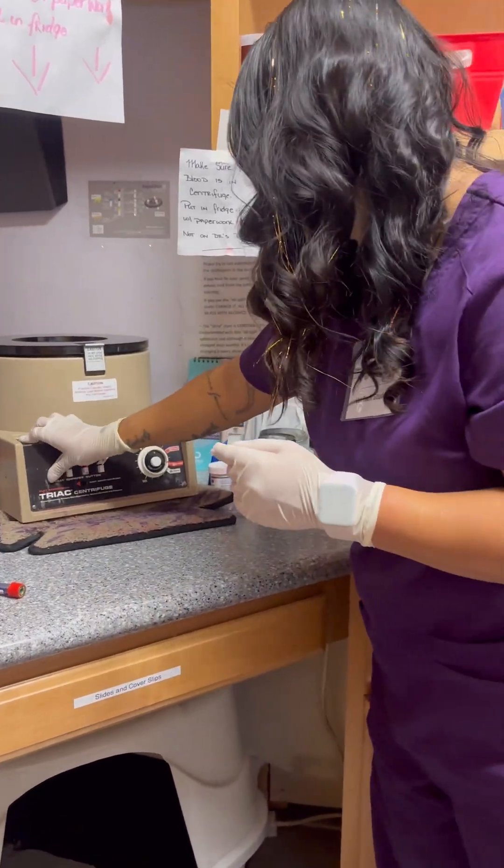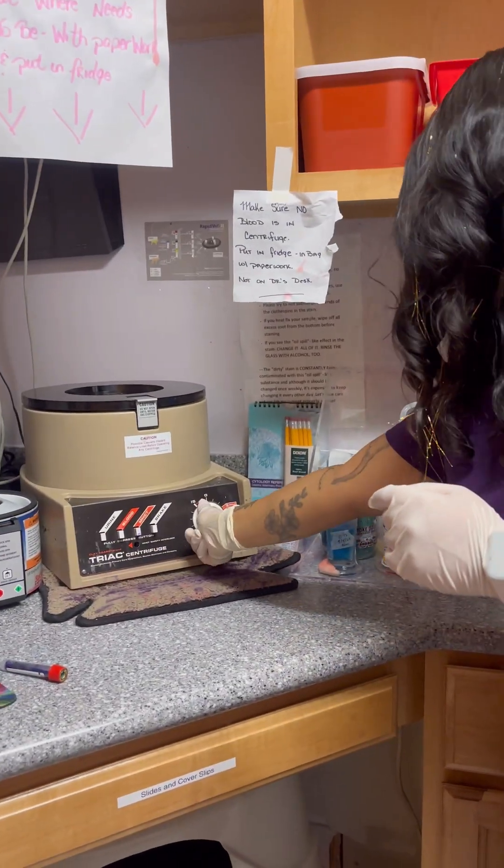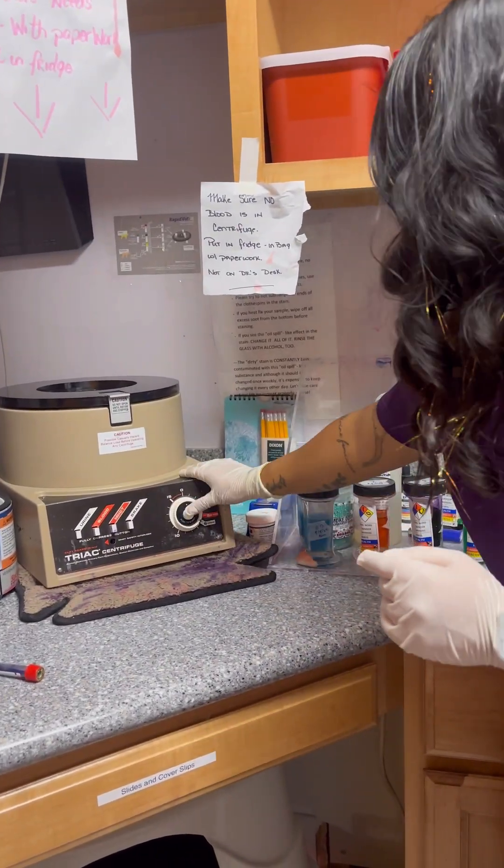I'm going to set it to urine. Press start.